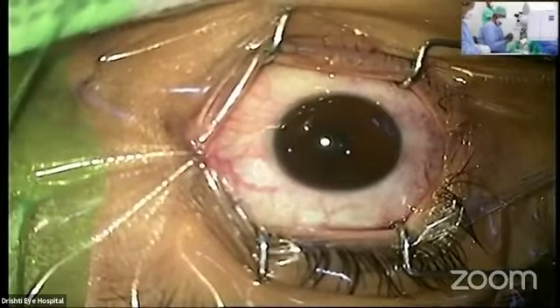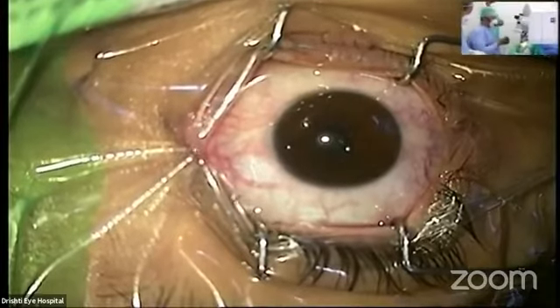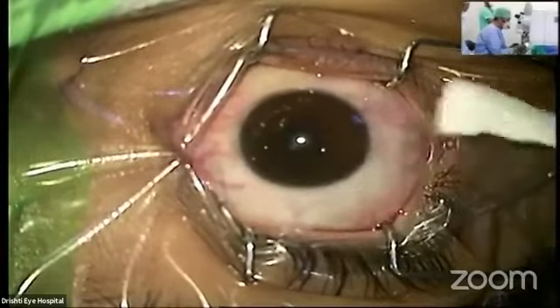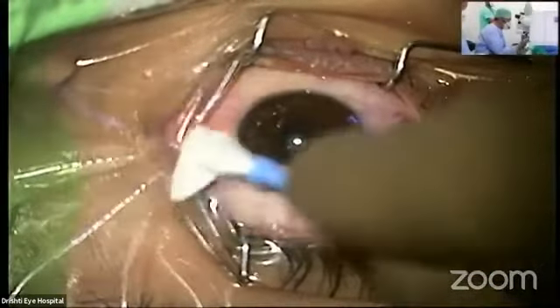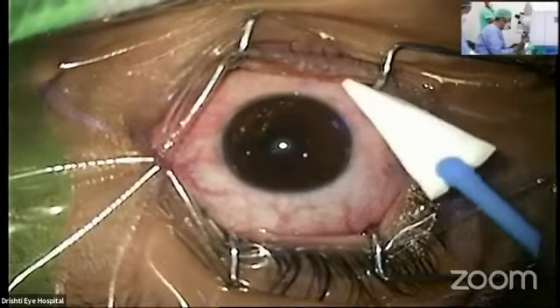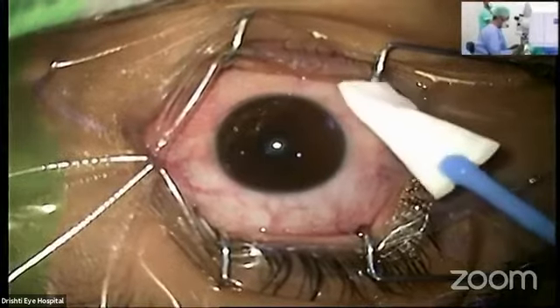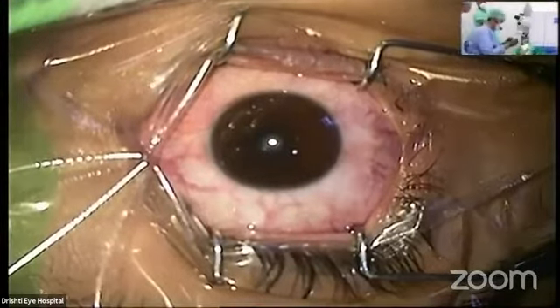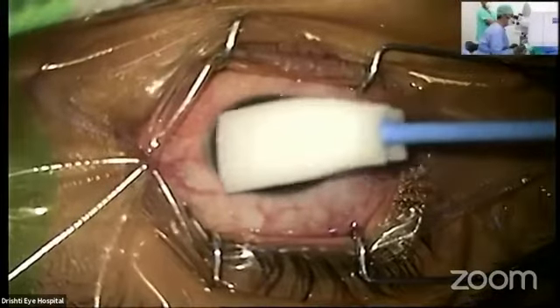Can you look into the light, please? What's different with LASIK is that here we want the cornea to be nice and wet, but the conjunctiva to be dry, because this is a corneal suction and patients are very comfortable throughout the procedure. I am now going to soak all the extra fluid on the conjunctiva. I hope my surgical screen is visible to you now — microscope view. We have to ensure that the conjunctiva is nice and dry, but the cornea remains wet. We take extra precautions because this is a much gentler suction than happens with most other femtosecond lasers, and the patient is actually able to see and fixate. I am joined here by Dr. Himanshu Mehta, who is visiting from Bombay and will be operating later in the day. We will take some expert comments from him. We have already primed our cone for the interface for the SMILE procedure, and now I have dried up the conjunctiva, but I am going to wet the cornea to make sure it remains wet.